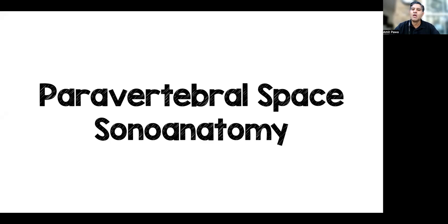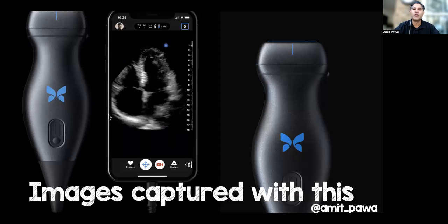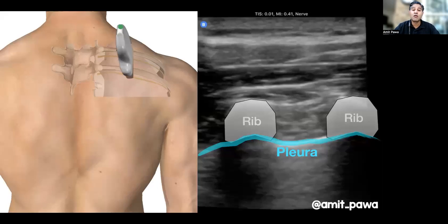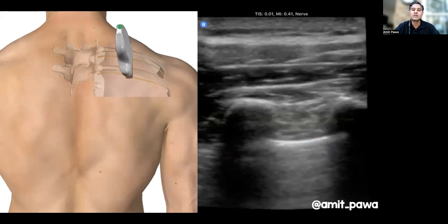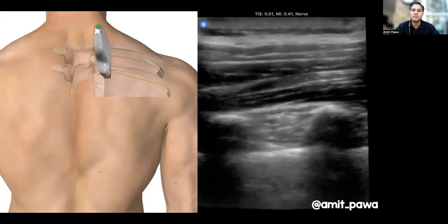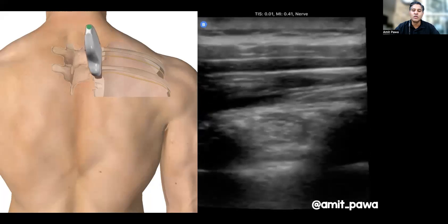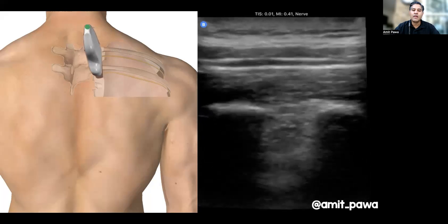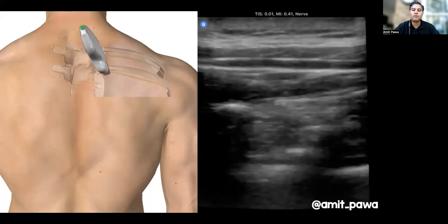What about sonoanatomy? I've captured these images using a Butterfly iQ probe, and we're going to start off with a paramedian sagittal scan. I start intentionally laterally over the ribs because I want to spot the transition from ribs to the transverse processes. As I slowly slide the probe from lateral to medial, you'll see the ribs dive down and then become replaced by a flat, tombstone or rectangular appearance of the transverse processes.